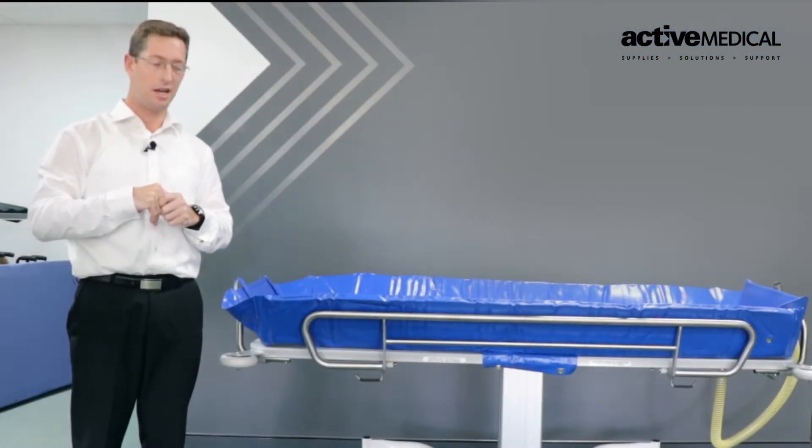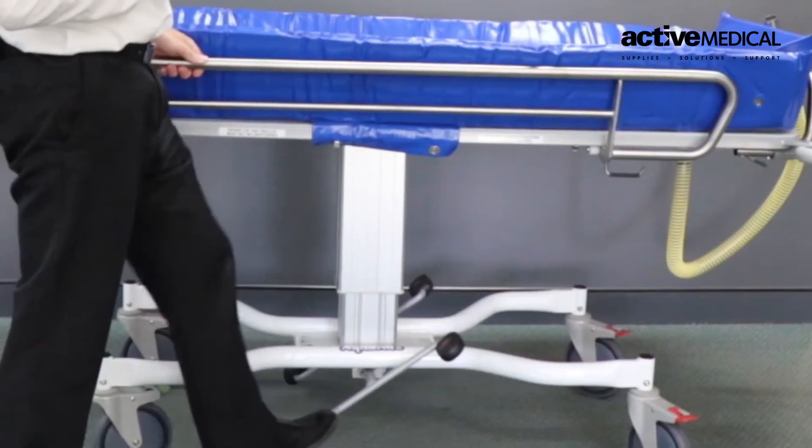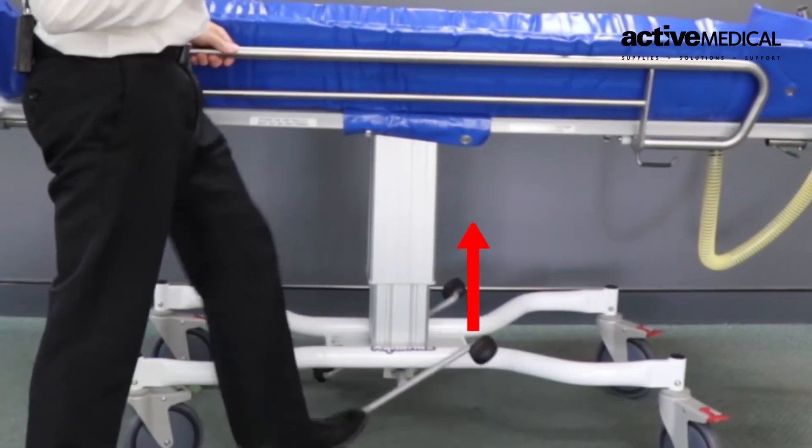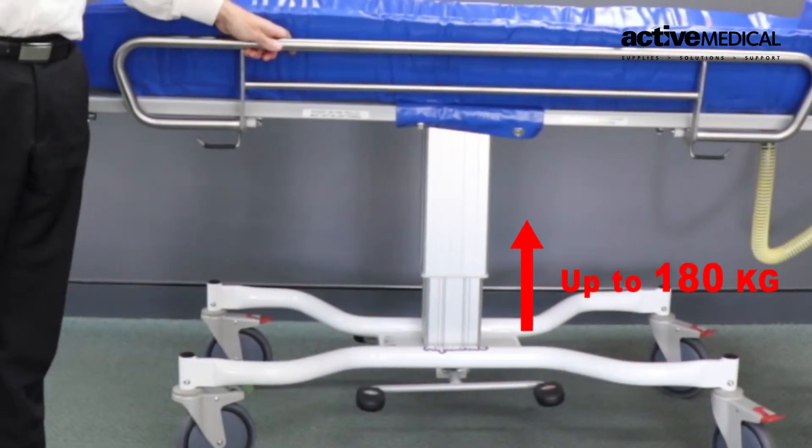We have our raise and lower pedals. I can raise the product up with ease, thanks to the fluid strut — raising anyone of up to 180 kilos.